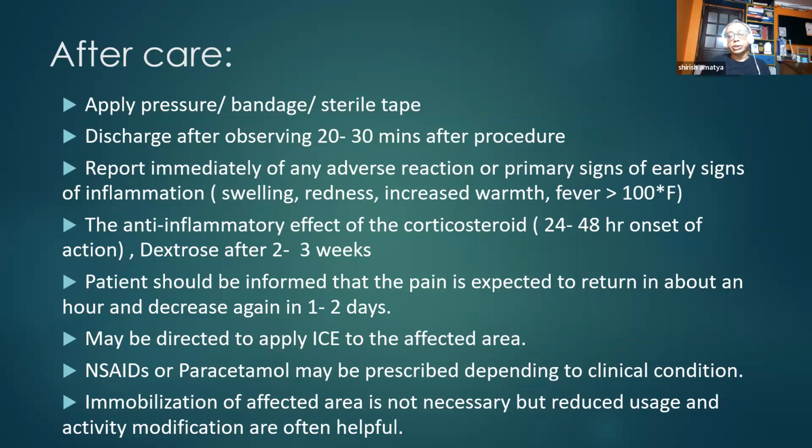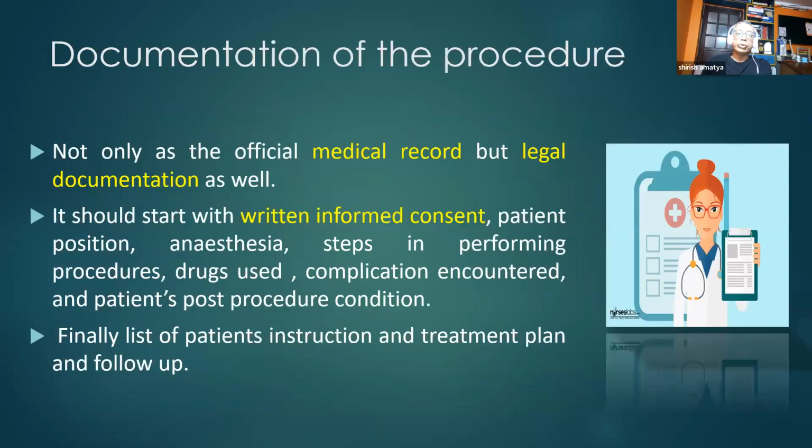But if the injection volume is large, or if the patient is apprehensive, then we can ask the patient to immobilize the area of injection for a few days and restrict heavy activity. Normal activity can be done following injection of both steroid as well as dextrose. And finally, there is documentation of the procedure.